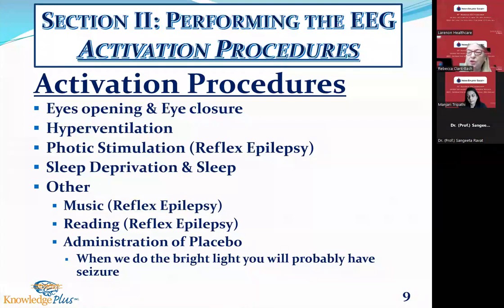And hyperventilation, you have to be a cheerleader to get that patient to do it in a manner that really facilitates finding an abnormality if one exists. And we'll talk more about that later. Now, I am not going to talk about some of the more unique reflex epilepsies like musicogenic or reading epilepsy, hot water epilepsy, walking epilepsy.